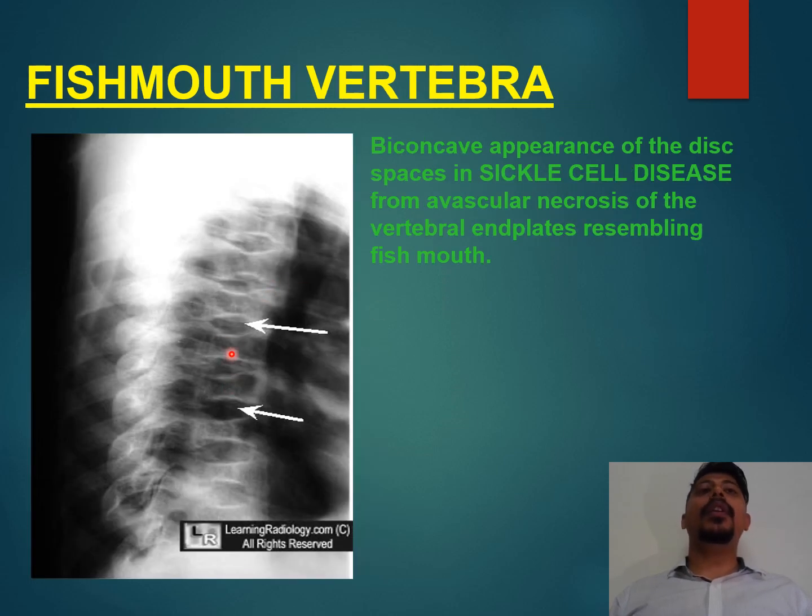Fish mouth vertebra. It gives a biconcave appearance of disc spaces in sickle cell disease from avascular necrosis of vertebral end plates, resembling the fish mouth.